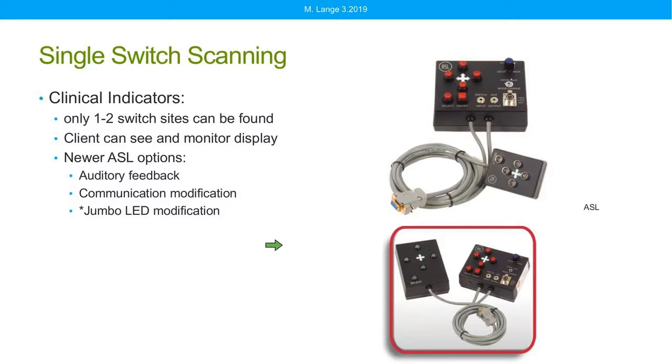There are some newer options to provide a larger display, to allow for some auditory feedback. It's a beep for clients who might have some difficulty seeing this display. It's a very tedious way of driving. The first thing I try to do if I see someone who's using single switch scanning is to find a couple more switch sites. But if we can't, it is a method of driving.